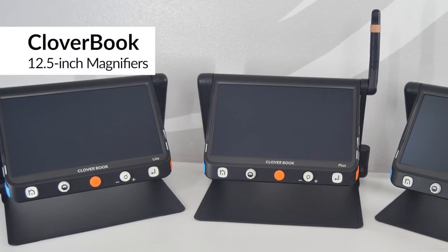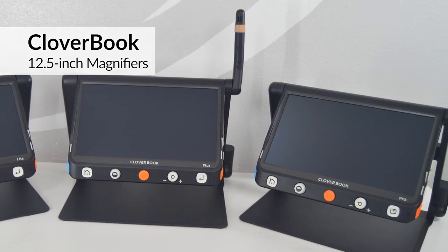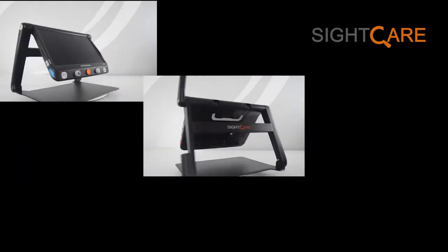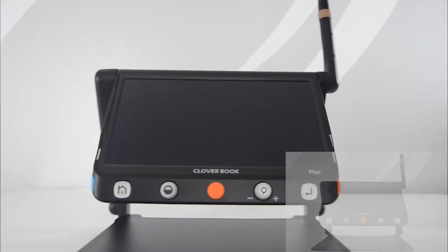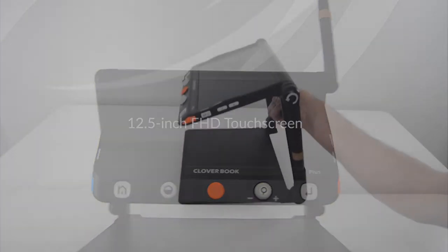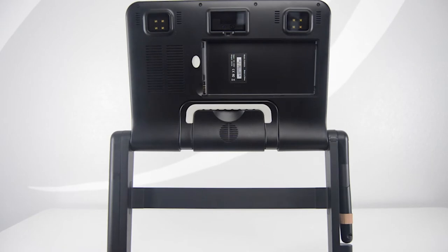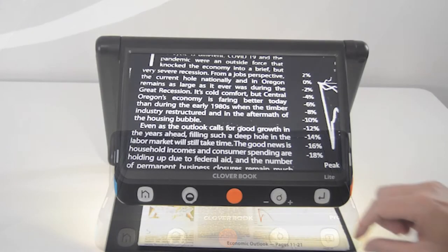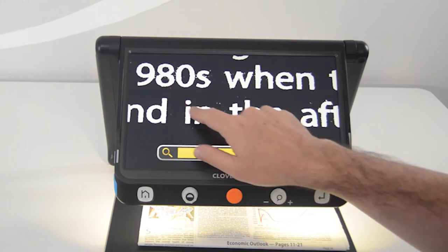SightCare offers several large screen devices that are perfect for reading at home, yet are still portable so you can easily take them with you. The new Cloverbook line from SightCare brings us several new options: Cloverbook Lite, Cloverbook Plus, and Cloverbook Pro. All Cloverbook models include a 12.5-inch Full HD touchscreen, weigh just 5.3 pounds, and have a rechargeable user-replaceable battery. The Cloverbook models have tactile buttons and turnwheels, just like traditional magnifiers, and they also have a touchscreen.